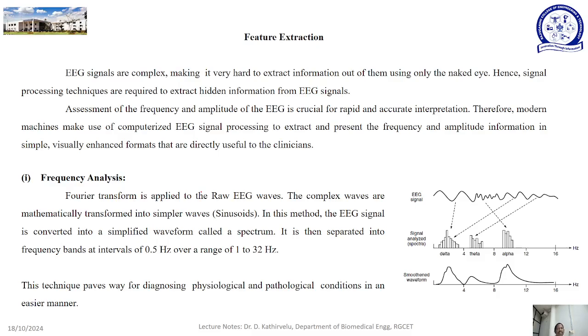Then we'll move on to feature extraction. We need to extract fiducial points, landmark points of an EEG signal, to make prompt diagnosis and to enable classification of EEG as normal or abnormal. We need to train a computer. For example, as we are moving towards automated, computer based systems, we feed the system with an EEG, and the system is supposed to respond whether the EEG fed into it is a normal or an abnormal EEG.